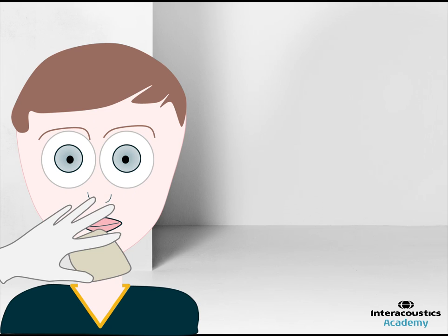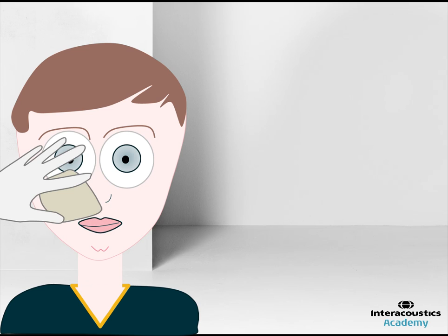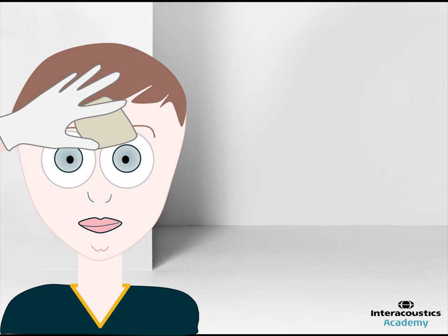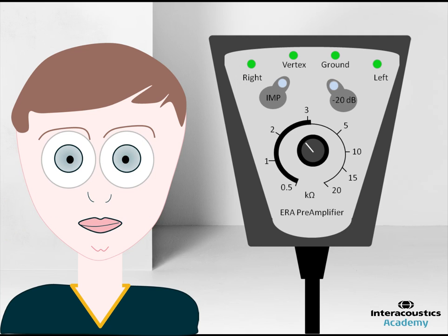Just like ABR, the electrode sites must be prepared and cleaned in order to obtain acceptably low skin impedance. It is recommended to have impedance values of 3kOhms or lower. The impedance values between one another should be similar.